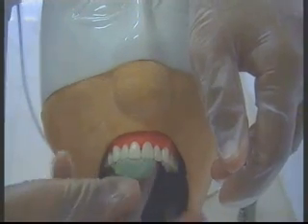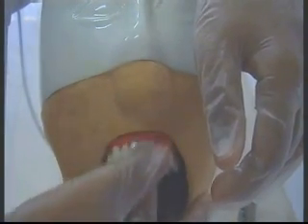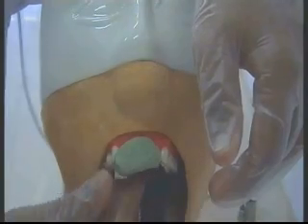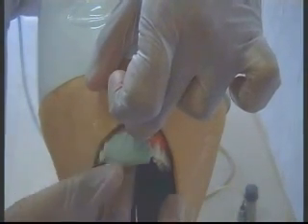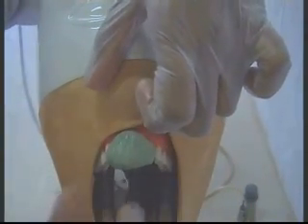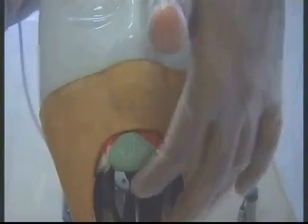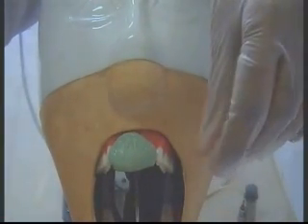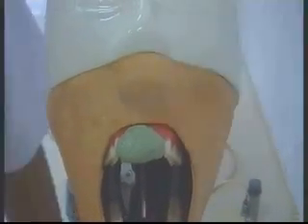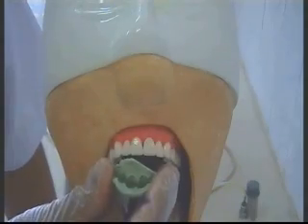The putty is adapted to the tooth that is required to be prepared, and it should cover the adjacent tooth structure also. As in this case, I am covering both teeth 1.2 and 2.1. After preparation, this will act as a rest so that it prevents the over-seating of the index. Once it has set, we are just going to remove this.